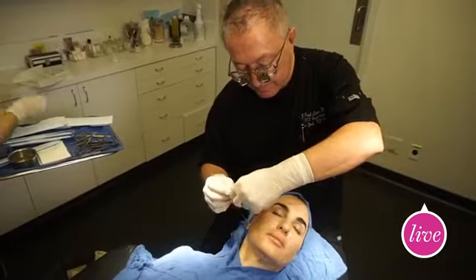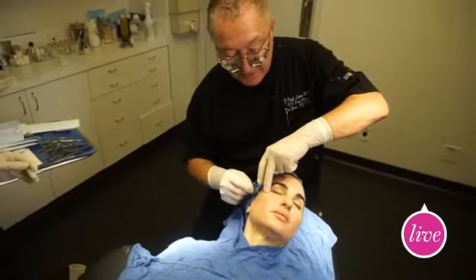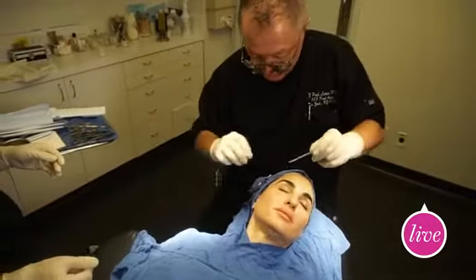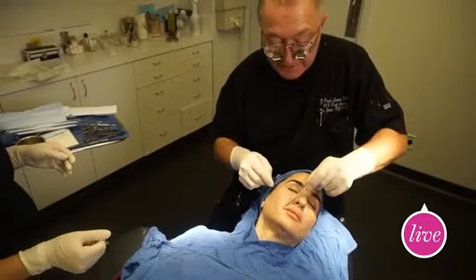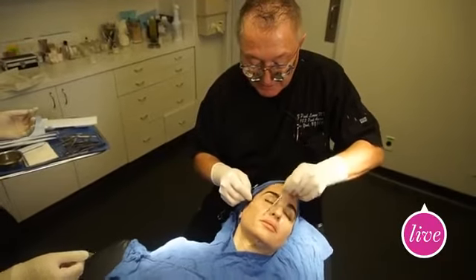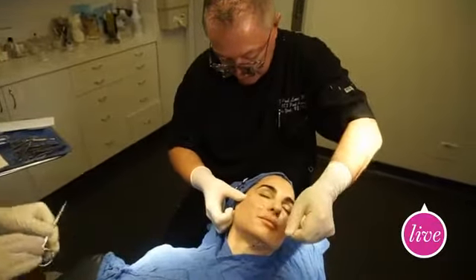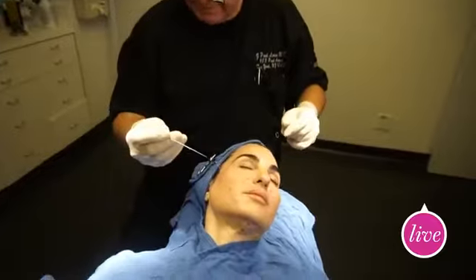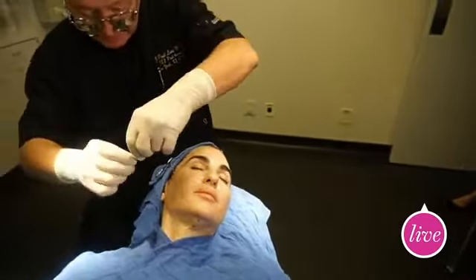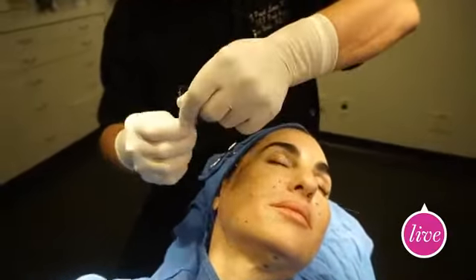And now, why would someone choose this over skin tightening procedures? Well, it does 2 different things. Skin tightening, and I do combine skin tightening. For instance, Thermi, I love ThermiTight, which is a radiofrequency device that does do skin tightening. This is more of a lifting procedure and a volumizing procedure, more so than a skin tightening procedure. How long does it typically last? About 1.5 years. It varies from patient to patient, but typically we see the effect lasts for 1.5 years.